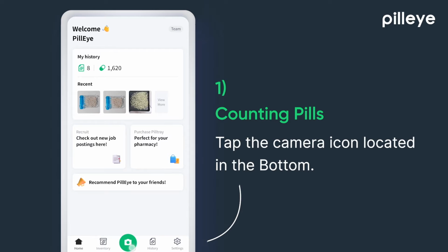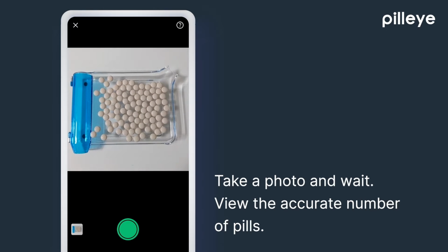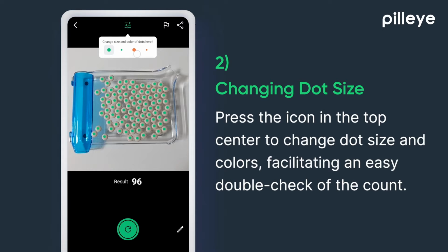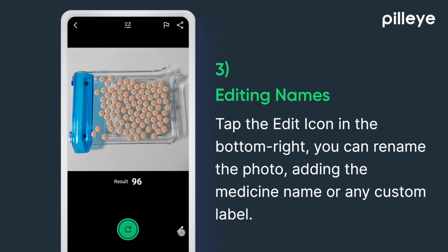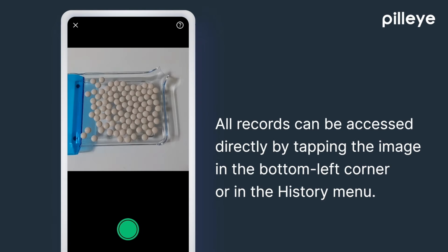To start, open the PillEye app, sign in, and tap the camera button to take a photo of your pills for automatic counting. You can modify the pill recognition dots for count verification and adjust settings as needed. Rename photos for record keeping by tapping the edit button and entering the medicine name or a custom label.